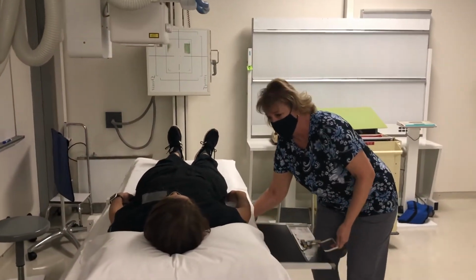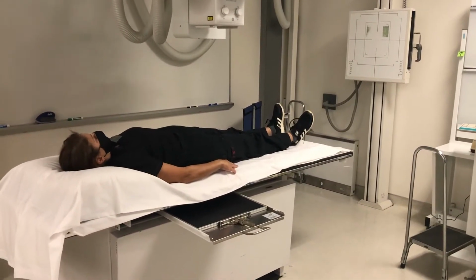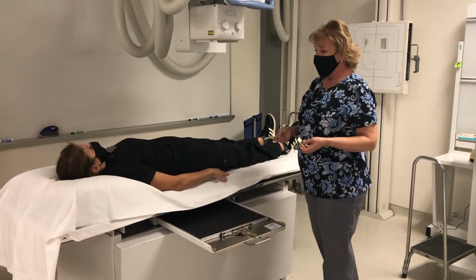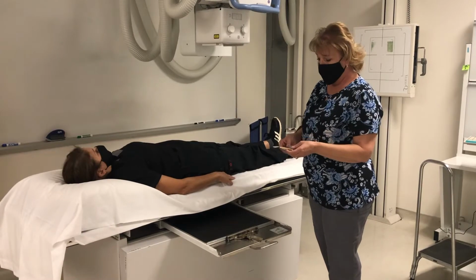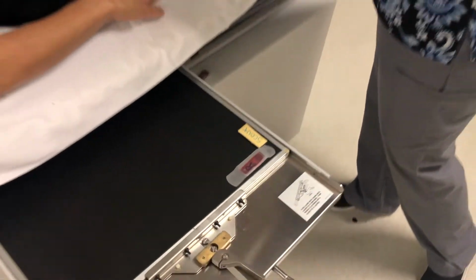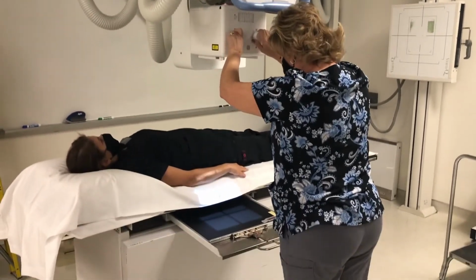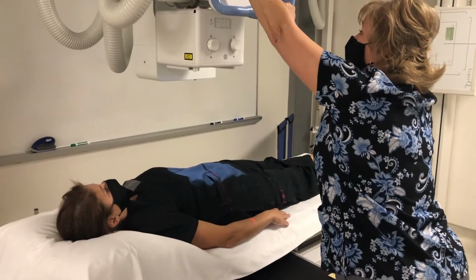This is called a scout film because a scout, and I'm sure this probably started as a military term, is the one that goes ahead to see if everything is clear, and so they just adopted that term for this. The scout film is going to make sure that her bladder looks empty and that she doesn't have a lot of gas or maybe undigested food that would obscure us seeing the urinary system. So I'm placing my right marker as well as a marker that indicates this is a scout film. This is a kidney, ureter, and bladder shot, KUB, done at 40-inch SID. And I need to be sure to include the kidneys, ureters, and bladder.